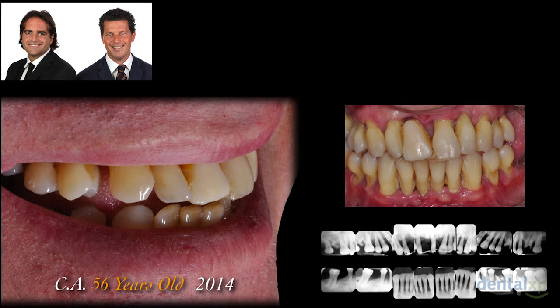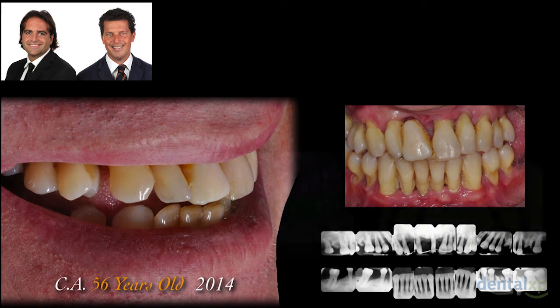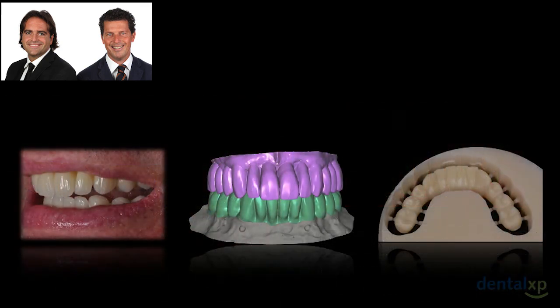For example, let's take this last case, in the last 2 minutes: full arch implants, upper restoration, full arch implants, lower restoration of this patient. What do we need to do? First of all, we need to improve his quality of life with a correct provisional restoration in the mouth, avoiding any kind of removable denture or removable prosthesis.